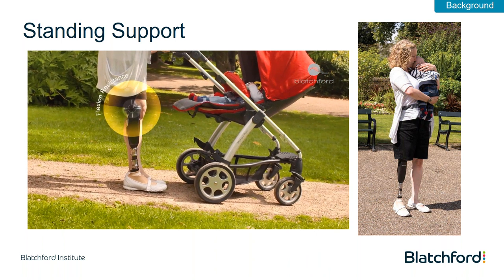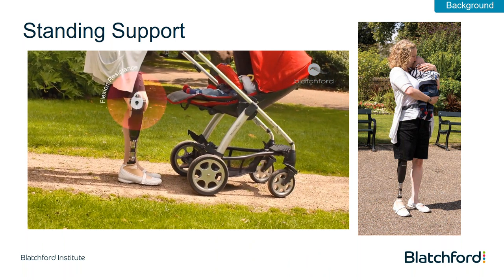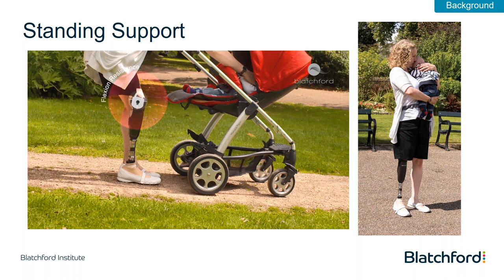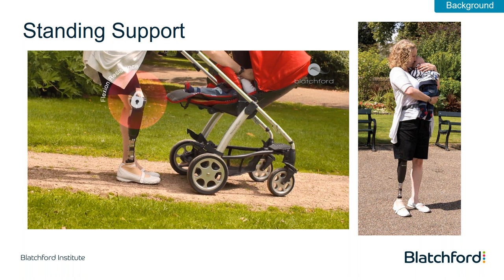On this video here, we can see Becky, the young mother we showed earlier on, stopping on the slope with her baby. So exactly as Chris said, she feels confident, she can stop there, do whatever she has to do. The knee will support her and her baby, even if the knee is not fully extended. So you can have the knee flexed and it will still allow the patient to hold an object or perform tasks. And one of the important things about this is how it grows the confidence of the user. So as our Orion 3 users grow in confidence in their limb, this breeds good practice and will help increase the mobility and activity of the amputee.